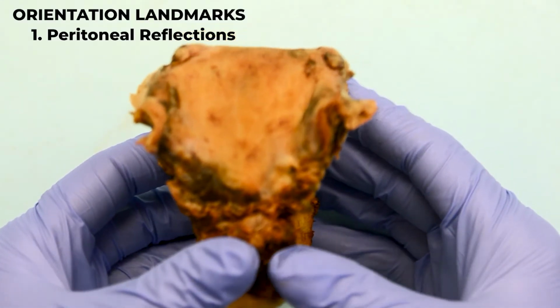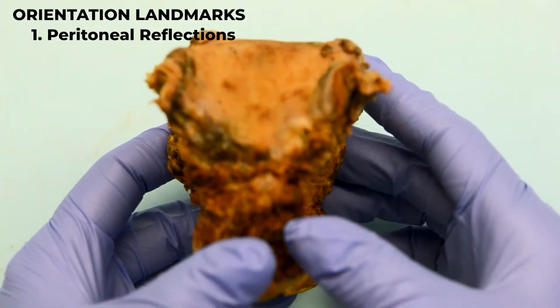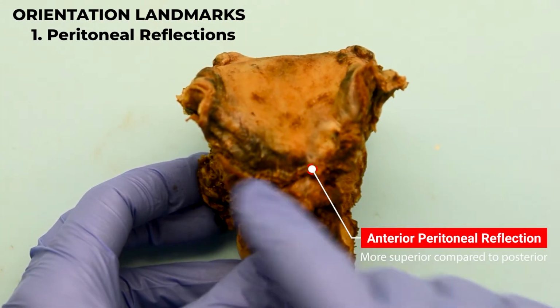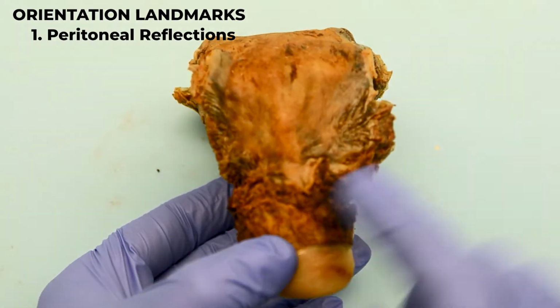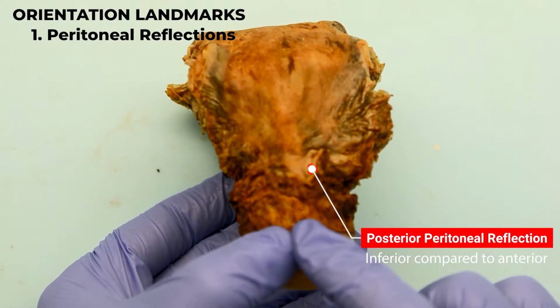Some of the key landmarks that we're using are our peritoneal reflections. On the anterior surface of our uterus, we will have a superior peritoneal reflection, which gives us this higher up looking flap of soft tissue. If we flip over to the posterior aspect, we can see that the peritoneum tapers down into a point and is more inferior on the posterior side.